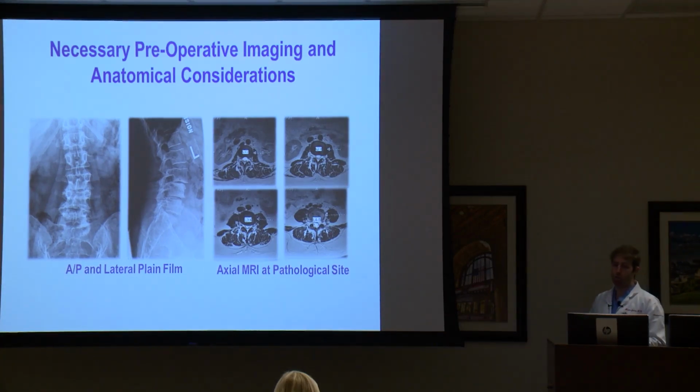And so if you're trying to restore that, another company can give you a little cage with 5 or 7 degrees, which is really going to get you like 3 or 4. That's where NuVasive took off. They said we've got 15, 20, 25, 30 degree cages. You can really crank them open and pop them open. Medtronic said, hey, we're missing out, so why don't we do 16, 21, 26, that they're just off by 1. It's kind of funny, but obviously someone's got the patent. So they're just off by 1, but they're big. You can crank them open, and so that honestly is probably why I use Medtronic or NuVasive more than anyone else: the retractor and the fact that they have those large degree cages.